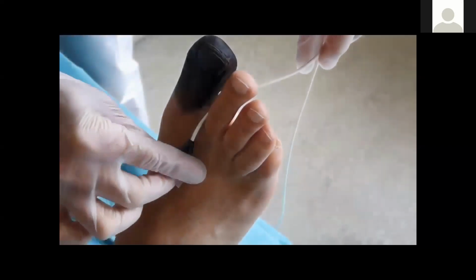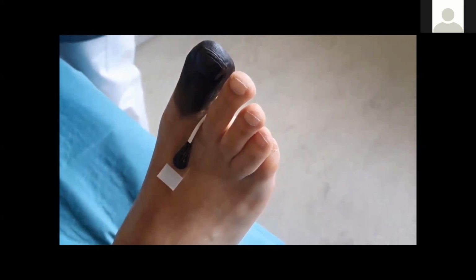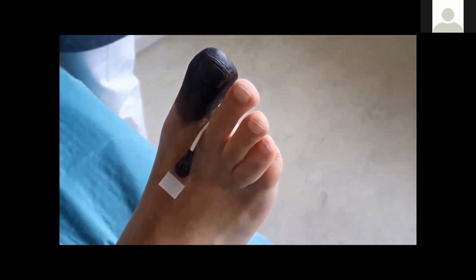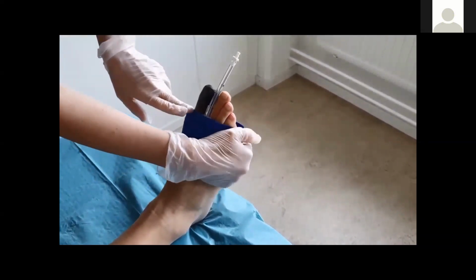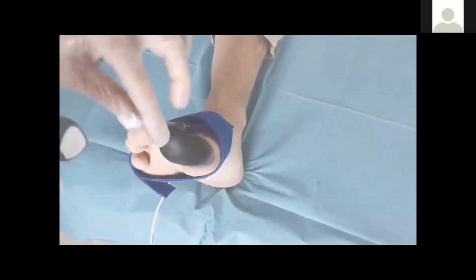SPP as a test is not affected by minor to moderate edema, and the tests can also be performed on sites with calloused and thickened skin. The blood perfusion is detected by placing the laser Doppler probe under the cuff. Cuffs are color-coded for easy recognition and connected to the corresponding pressure tube.